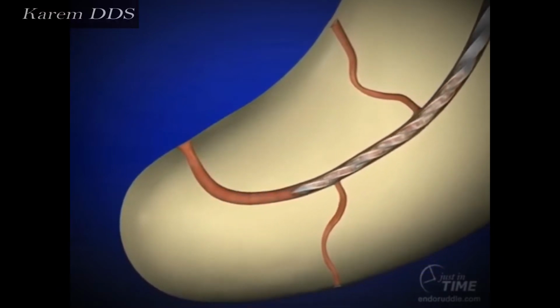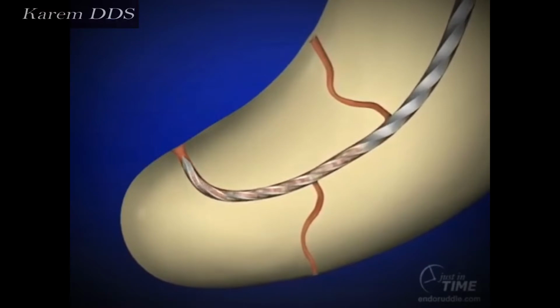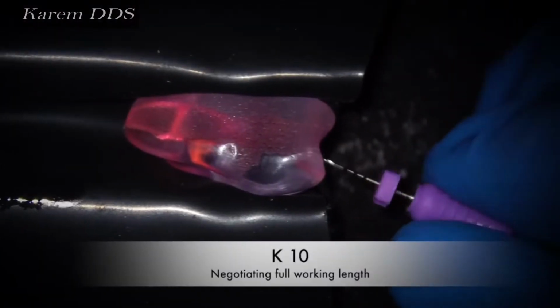If these steps are performed correctly, endodontic treatment can retain a tooth that would otherwise require extraction.